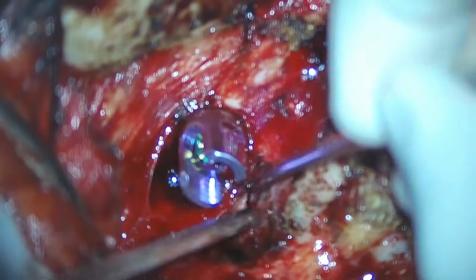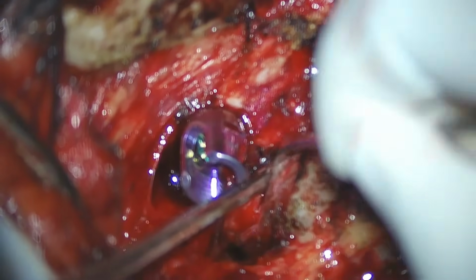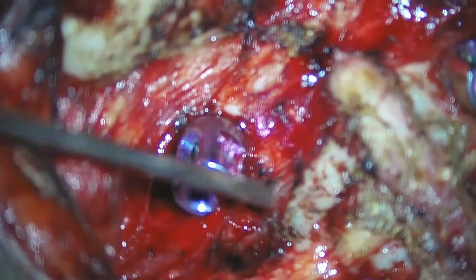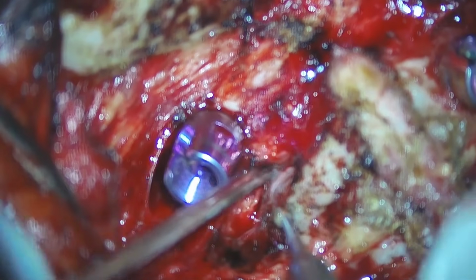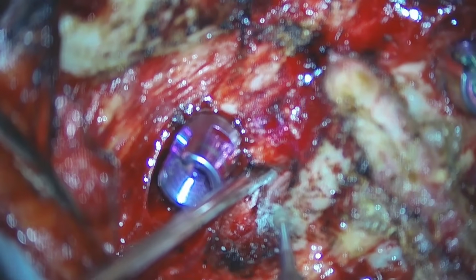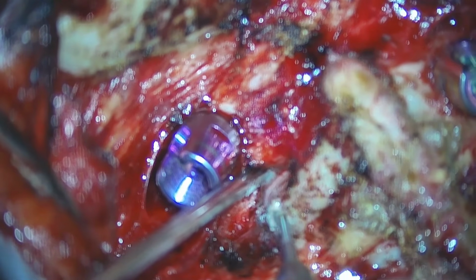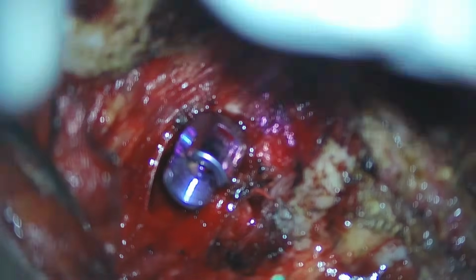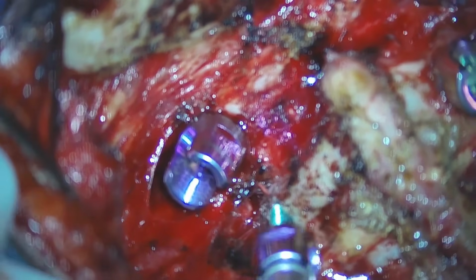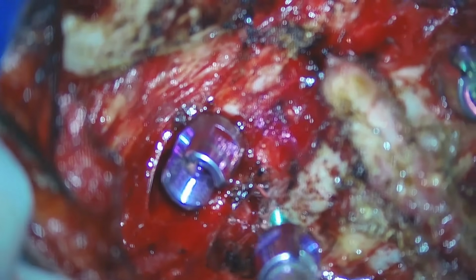Once this is done, we will again place a pedicle screw. Now we can see the direction of the pedicle of the C2. We'll make a decortication in the bone and direct our screw in the same way as the pedicle. Placing a C2 pedicle screw is very easy, and we just need to make sure of the boundaries of the C2 pedicle.